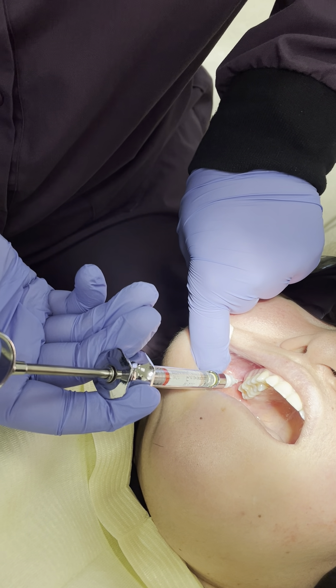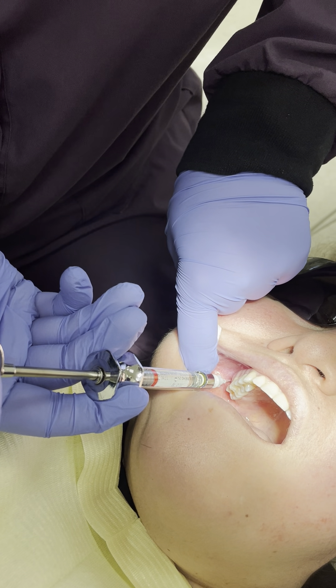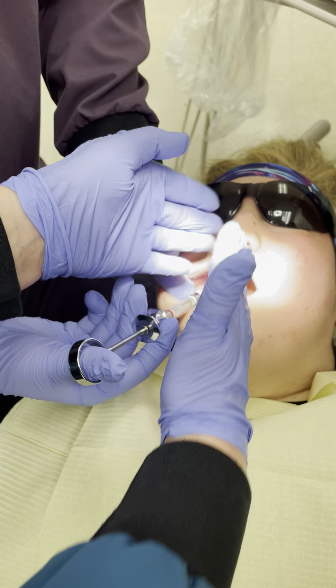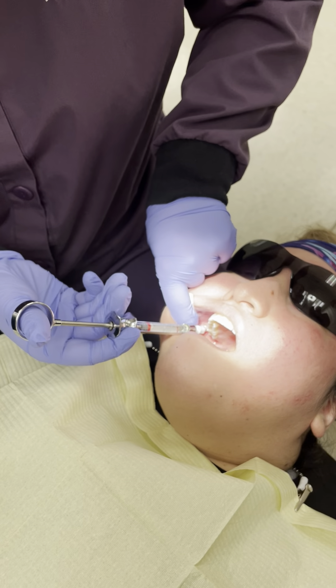Proceed. Aspirating. Negative. Proceed. Depositing. She's going to hold now. She is at a 45-degree angle from the mid-sagittal plane and her barrel is lined up with the ala of the nose, and that is a perfect PSA.